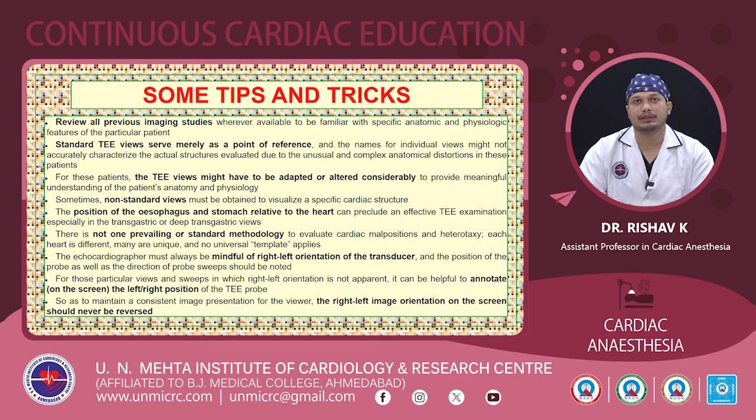Now, before we get to the details regarding examination, I'd like you to know certain tips and tricks so as to optimize the TE evaluation. Firstly, the echocardiographer will mostly be encountering a patient who has either undergone multiple imaging investigations, or may have undergone multiple staged surgical procedures in the past. So it is important for the echocardiographer to be reviewing all the previous imaging studies, to be familiar with the specific anatomic and physiologic features of the particular patient so as to be familiar with what to expect.